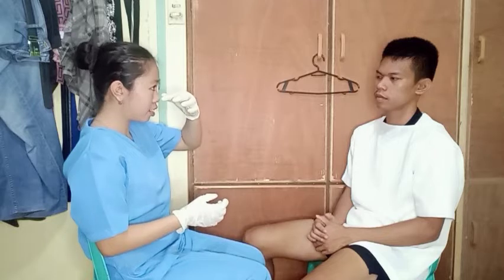Now have the client perform the Valsalva maneuver and observe the center of the tympanic membrane for a flutter. Okay, sir. Remember not to do this test on an older client because it may interfere with equilibrium and cause dizziness. So, sir, kindly pinch your nose like this, sir.